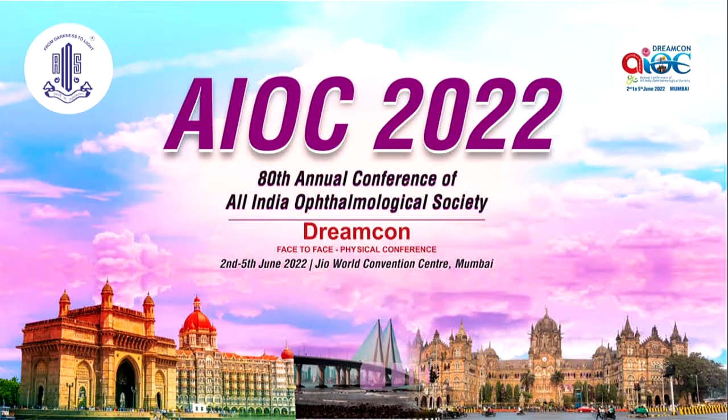Nice talk, Dr. Namrata. Just a query, supposing you have done a myopia laser vision correction, and you find that the epithelium has increased in thickness from say 50, 55 microns pre-operative to 65 or 70. And this patient has a -1 diopter residual error at 6 months, is there a role for just debriding the epithelium and not doing a recorrection? And if you do that, is the epithelium going to regrow to the same thickness, or is it going to go back to its normal and the error itself might get corrected? Because I did come across a paper where they have tried that for small amounts of refractive error.